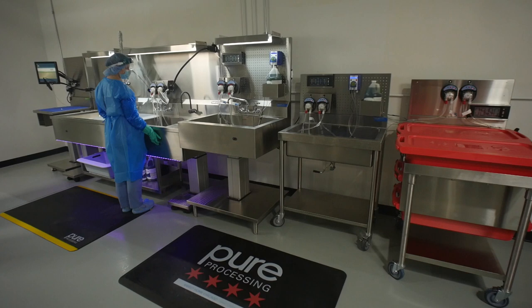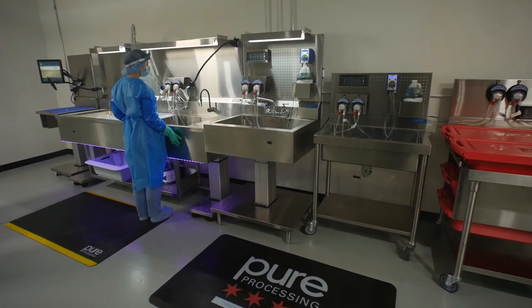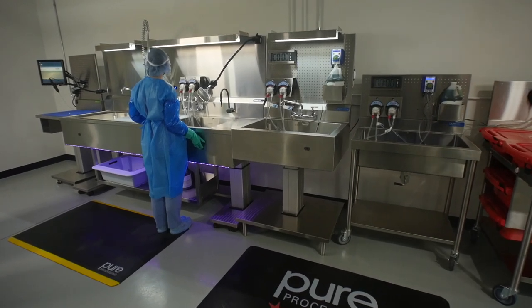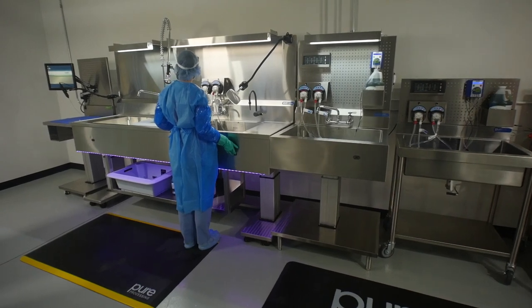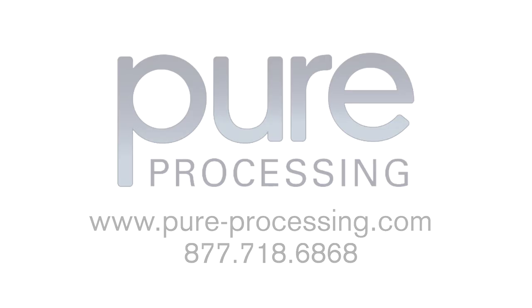Reprocessing flexible and rigid scopes is a multi-step process that requires meticulous attention to detail. Providing nurses and reprocessing staff with compliant and flexible equipment, setups can standardize and simplify complex scope cleaning. For more information about PureProcessing's rigid and flexible endoscope cleaning solutions, please contact us at 877-718-6868 or visit our website for more information about the products used in this video.